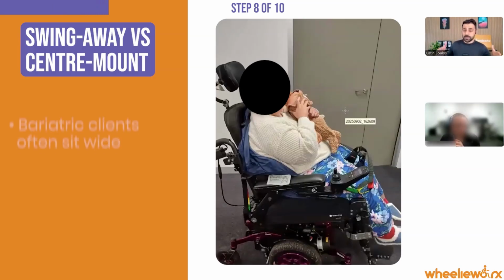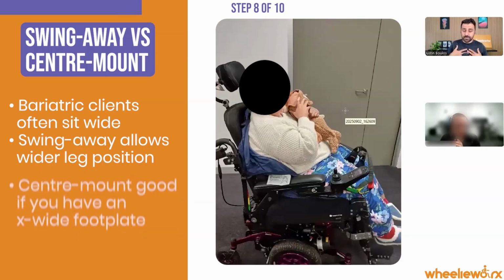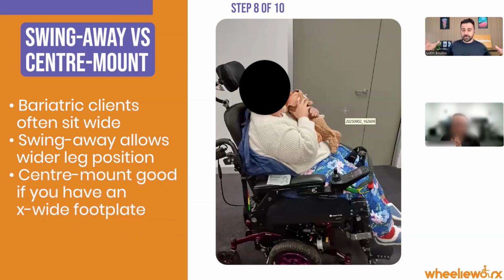A lot of people will say swing-aways are good for bariatric because they allow the legs to come out wider. But my opinion is I think we should go with a center mount with an extra wide foot plate, as long as it clears the casters. That allows us to keep our knees tucked in as much as possible, and means there's nothing on the sides to get hurt or damaged. And then you still get the ability to elevate them if you need to as well.